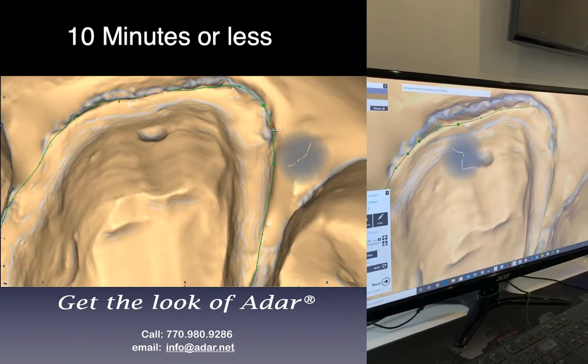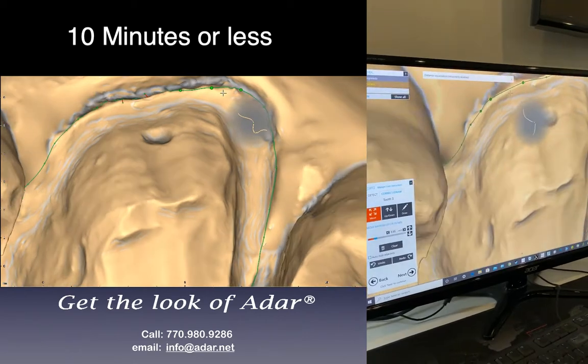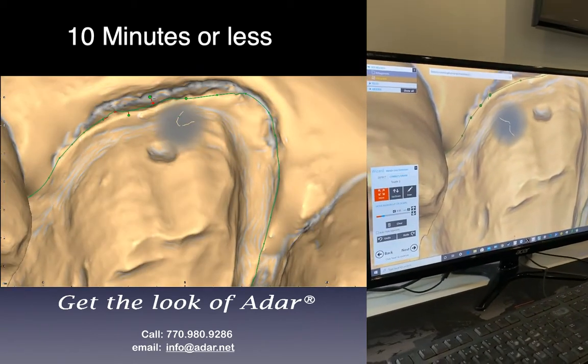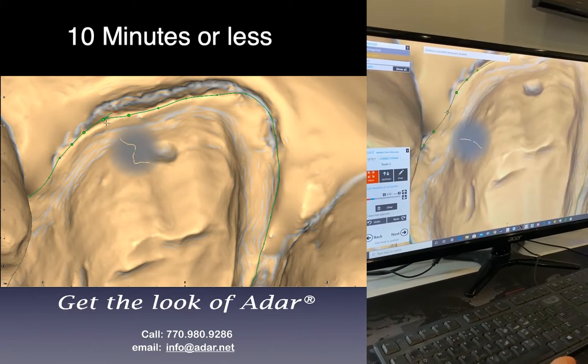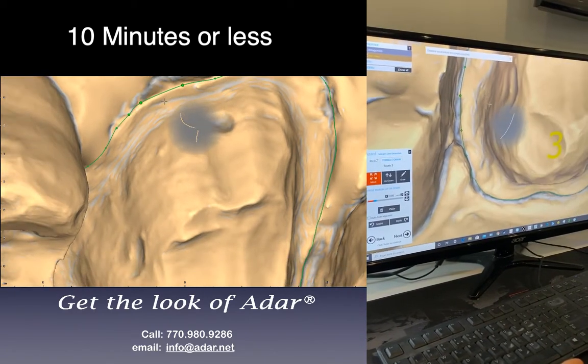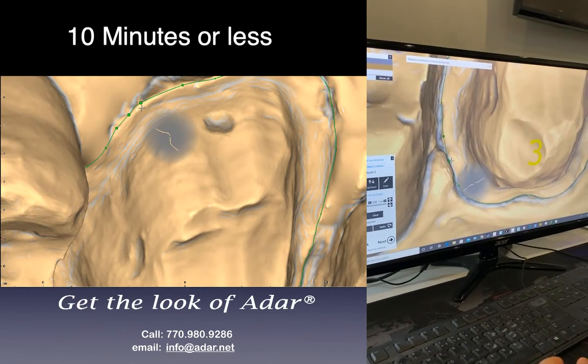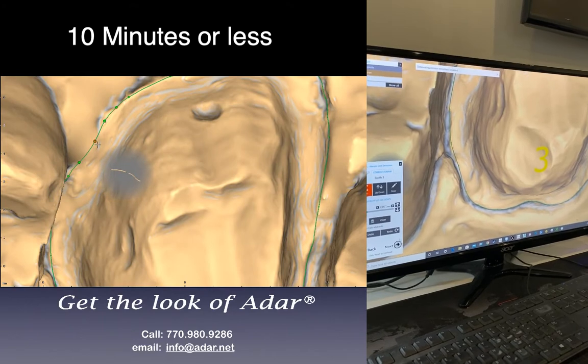If you want to delete a point, you just click on it and then push the right button and left button at the same time to get rid of it. This one's good, this one's good, this one's good, this one is not. Done. So I'll go next.